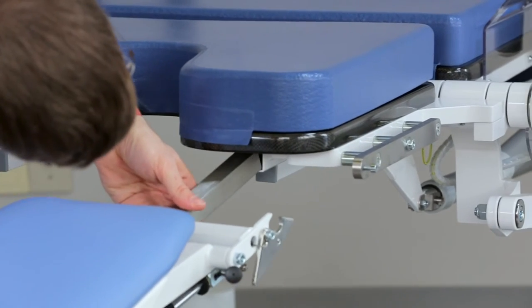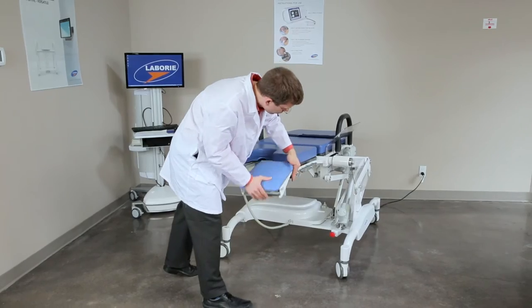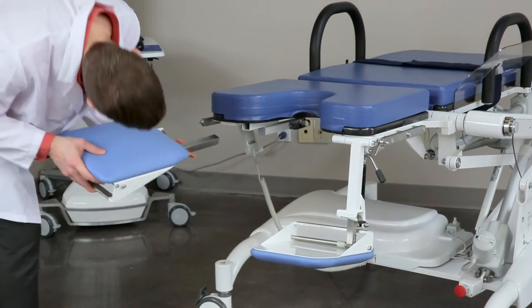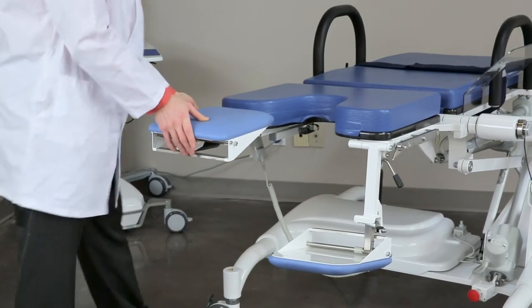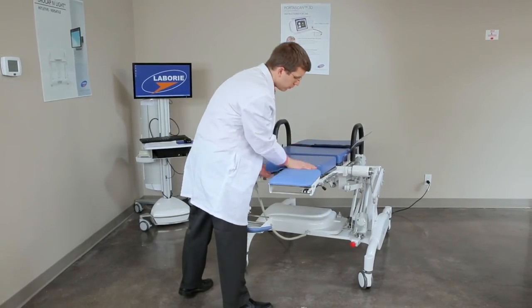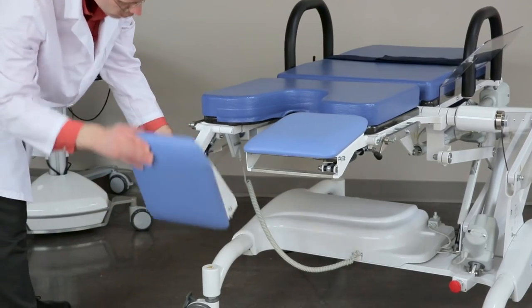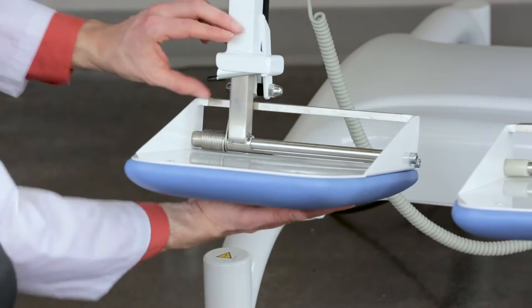Locate the square openings below the seat of the chair and slide the footrests into the tracks. The left and right side footrests can be identified by the silver triangle piece on each, which should be positioned toward the outside of the seat. To convert the footrests to become an extension to the seat, lift and push in the black lever while lifting the footrests up.